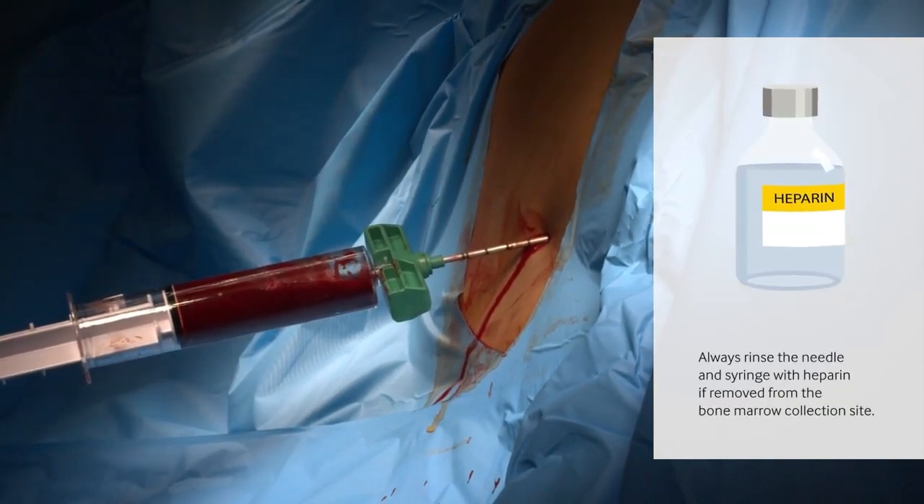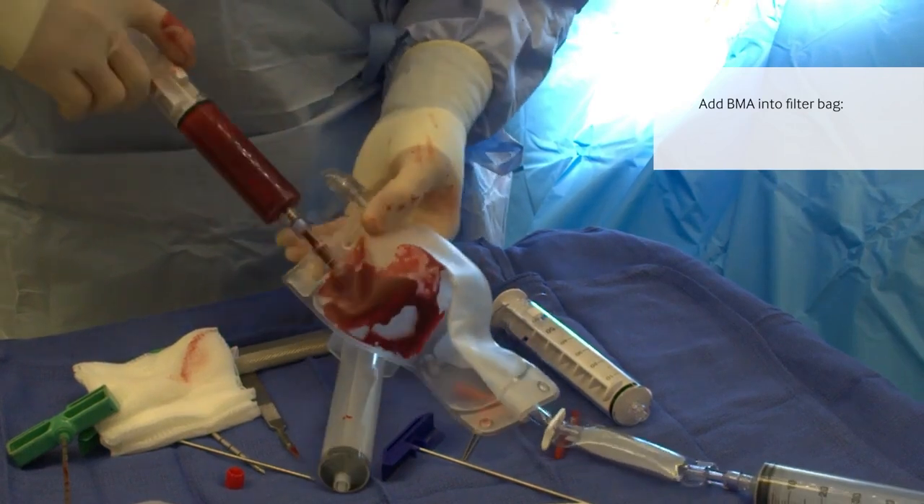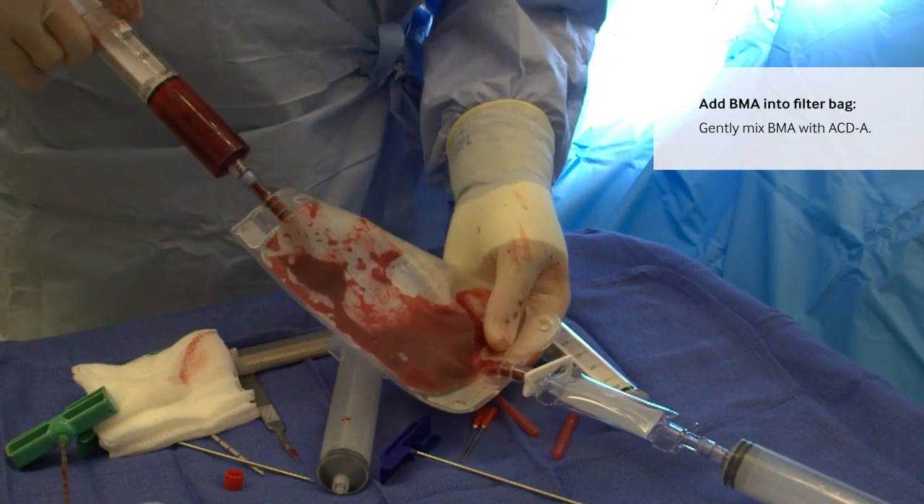If you remove any of the collection components from the bone marrow space, rinse them with heparin. Once bone marrow aspirate is removed, inject it into the filter bag. As it enters the bag, gently mix it.